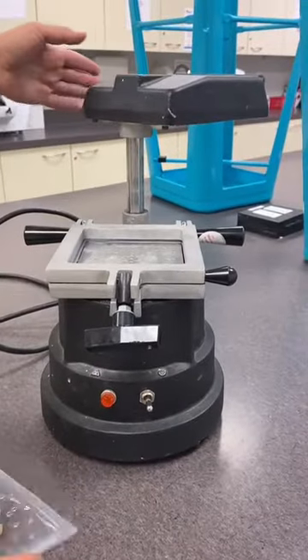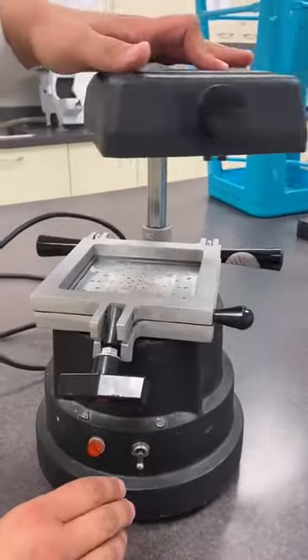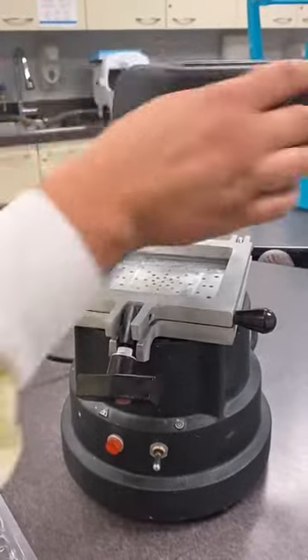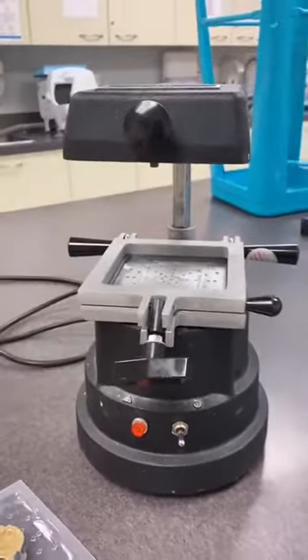Make sure that the heater never stays on, and when storing it away, the frame is down and the heater is back in place with the arm secured so it doesn't get damaged. And that's how you use the vacuformer.